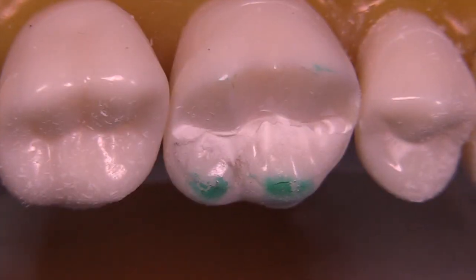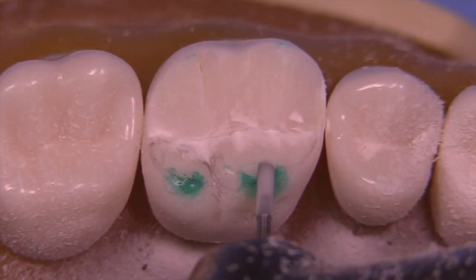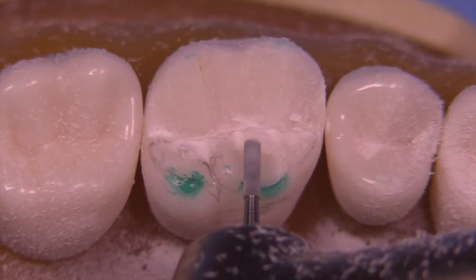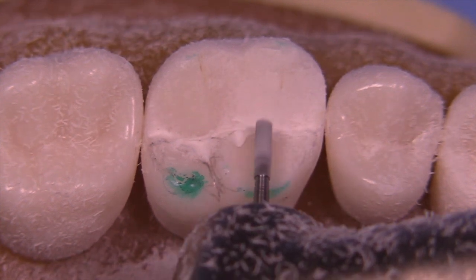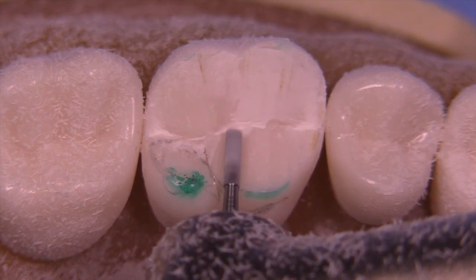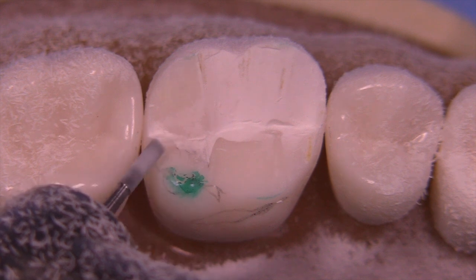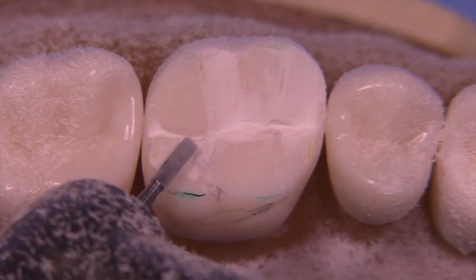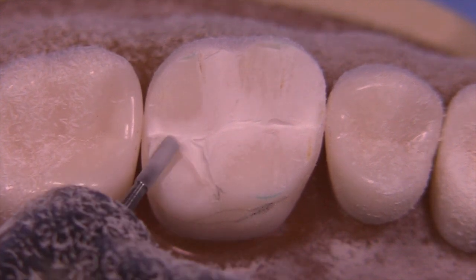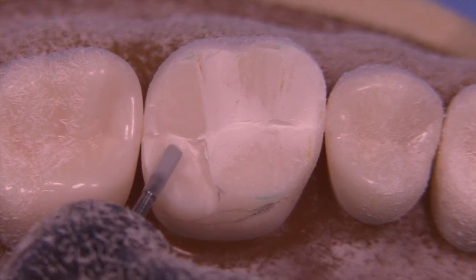Try to follow the natural inclines of the triangular ridges. On the lingual side, I typically go straight across the mesial lingual cusp facial incline to create kind of a heart shape, and then across the distal lingual to create more of a triangular shape. It's important to keep your burrs lined up properly so they don't gouge into the opposing inclines.